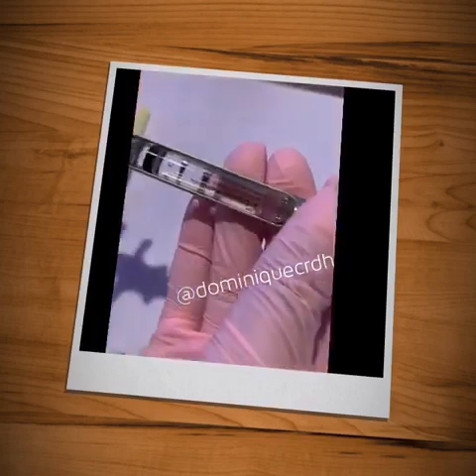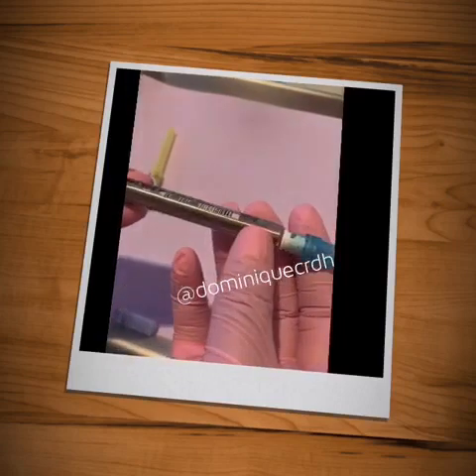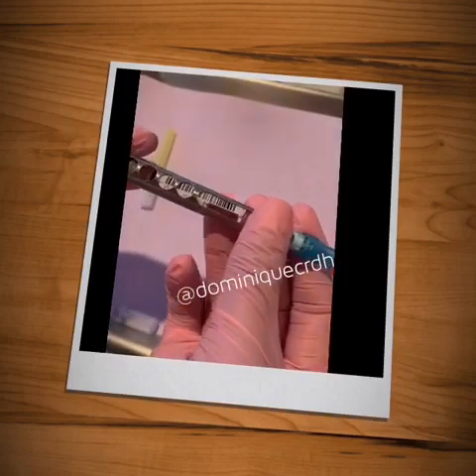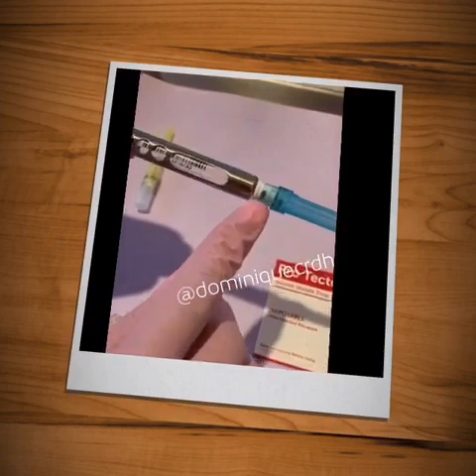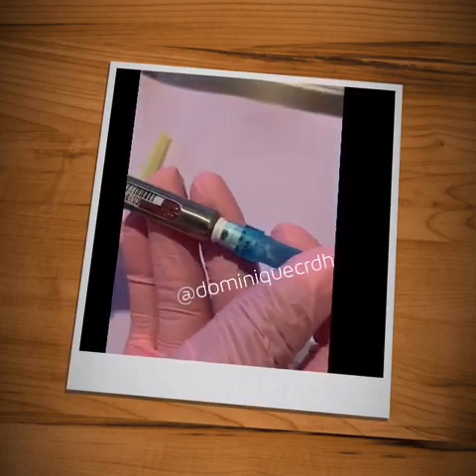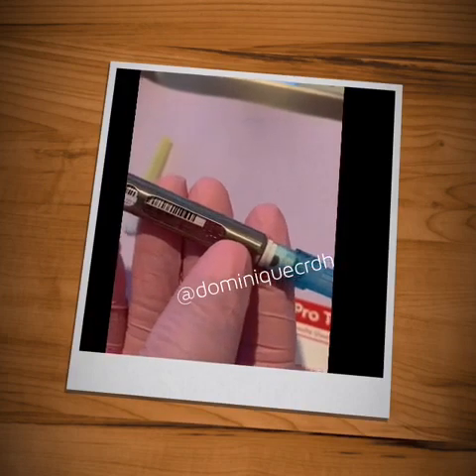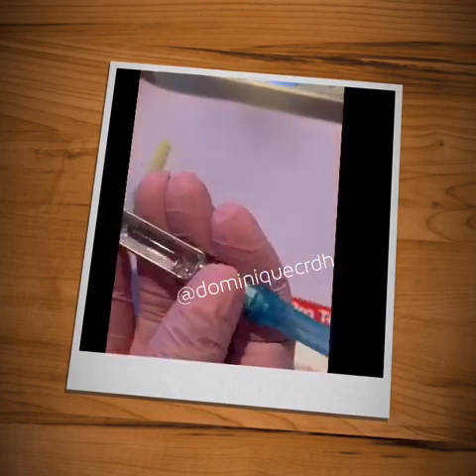All right, so we are tight, and there is the window of the syringe. If you flip over the syringe, the indicating arrow is right there, and it is opposite the window of the syringe. A really important step if you want to accomplish painless anesthesia. Okay, we are ready now to attach the protector shield.